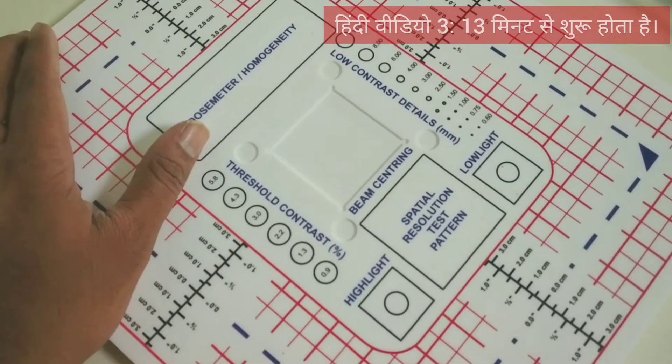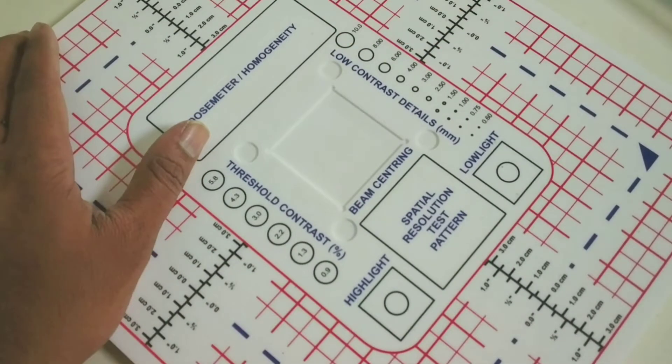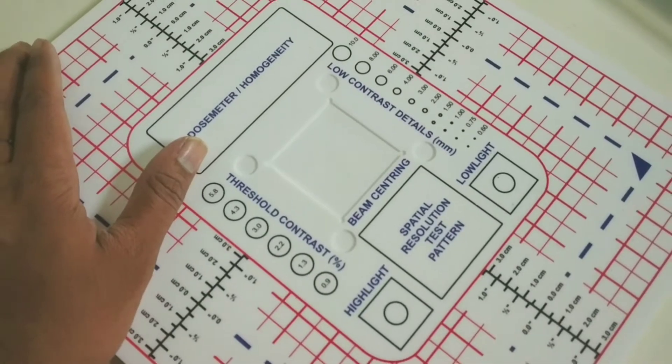With this, we can know the dose meter, homogeneity, threshold contrast, beam centering, spatial resolution pattern, highlights, low lights, and low contrast details of the X-ray machine.